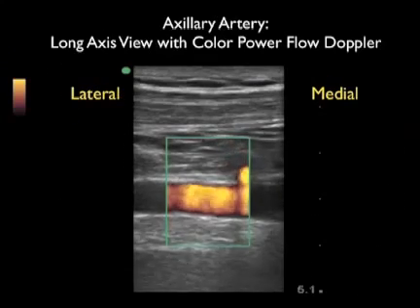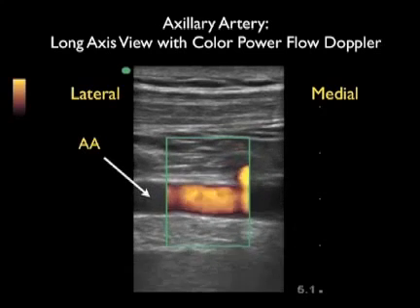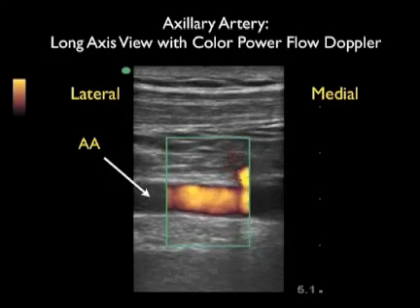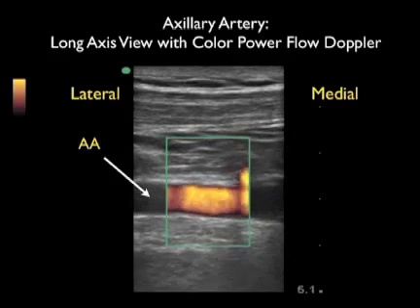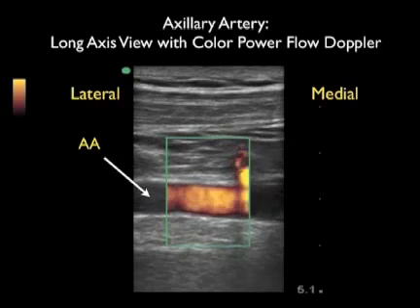Let's contrast that last ultrasound clip with this one showing the axillary artery using color power flow Doppler. Color power flow Doppler shows amplitude of flow, and we can see that fast flow is very yellow. We can see the faster flow within the inner part of the lumen of the vessel. But notice that we have here the characteristic arterial pulsations to differentiate from venous pulsations.